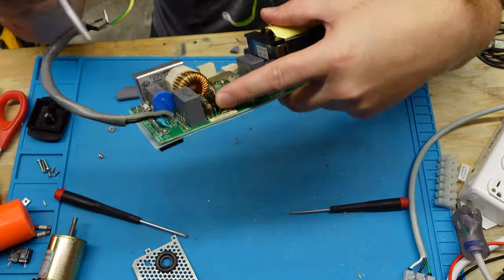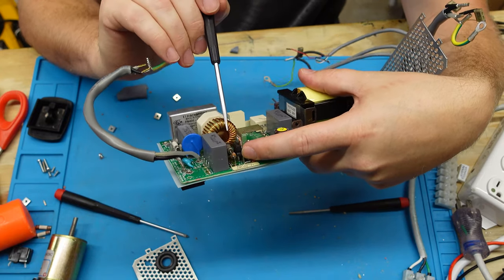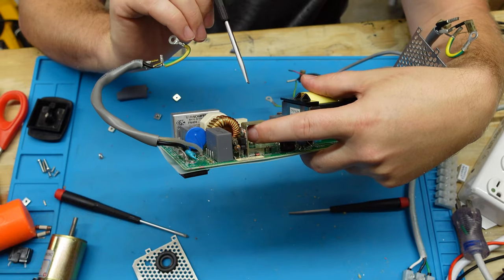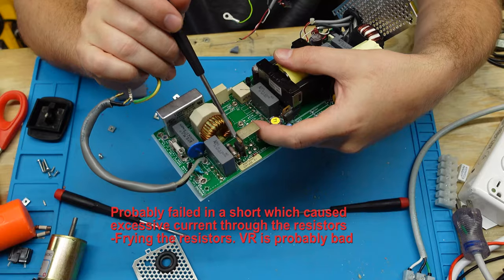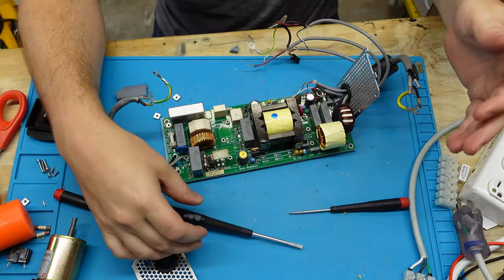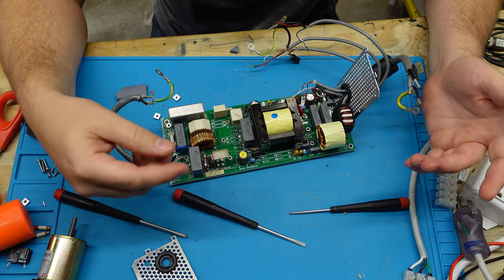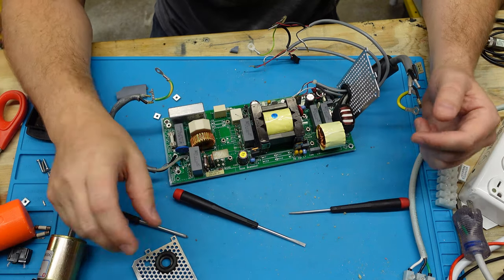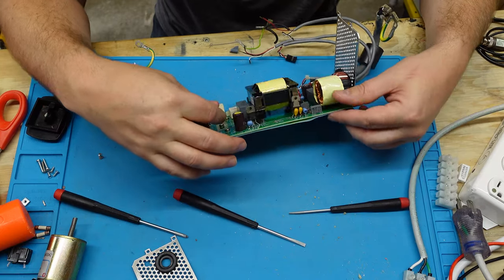But so far, I'm putting my bet on these resistors right here. I'm going to try and look up their values and see if I can find them. And I might just also replace that voltage regulator right there, because it has obviously dealt with some heat throughout its life as well. And everything else, I bet you, is perfectly good. Now, this is a $1,900 PSU, power supply unit, and I think I can fix it with probably $3 to $4 worth of components. And I'll put an order in today and see if I can get those on order.